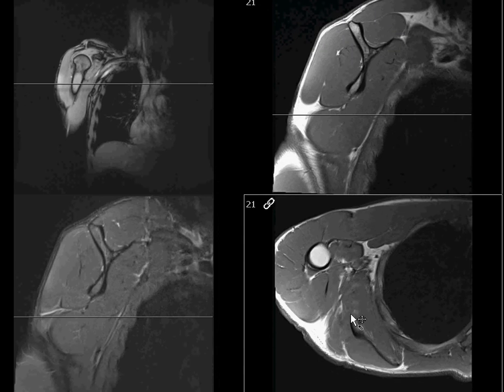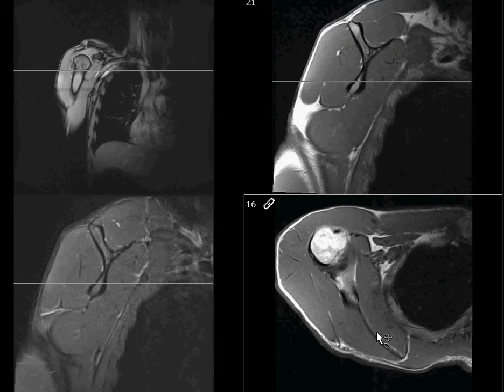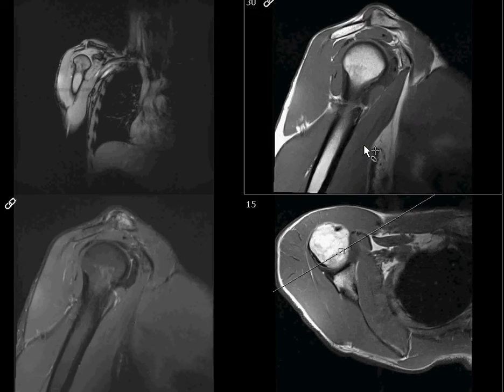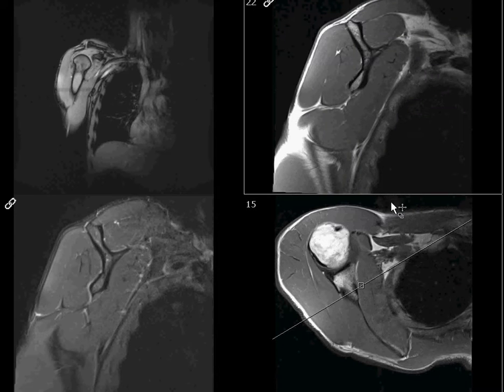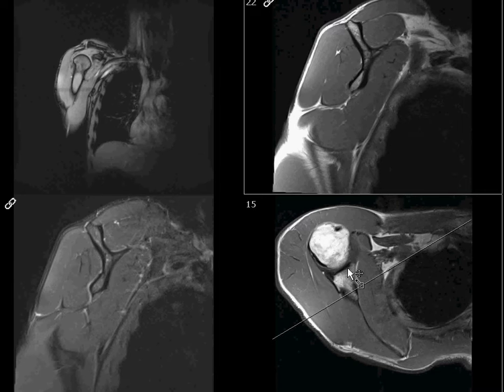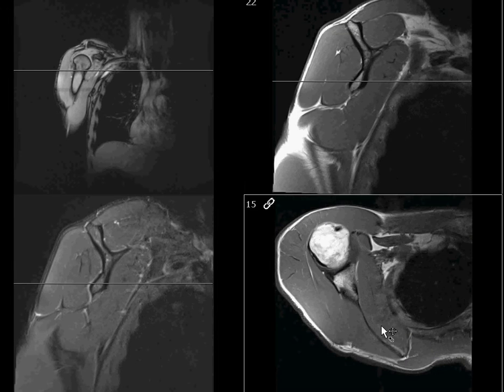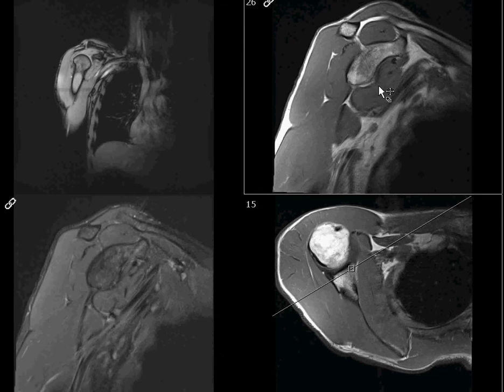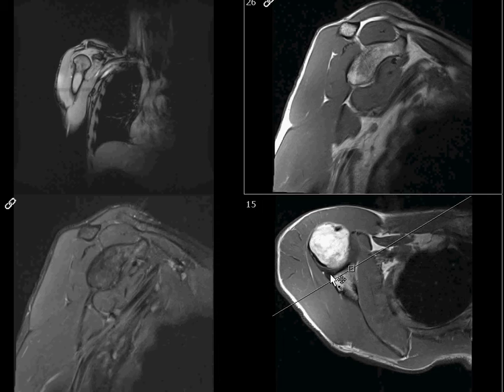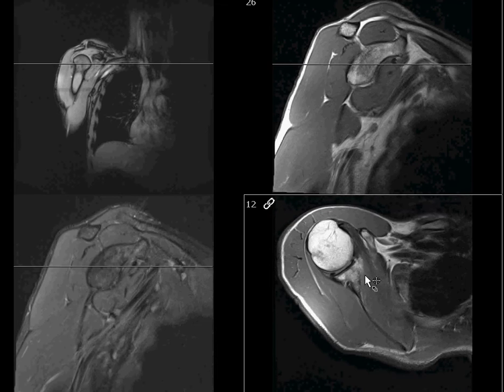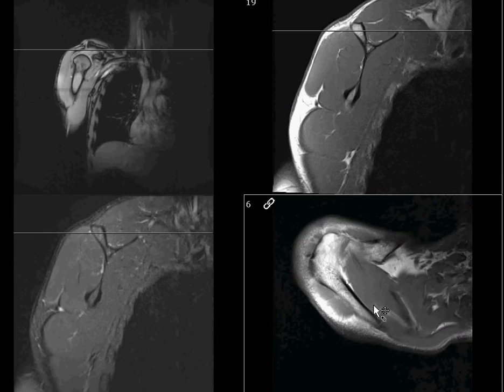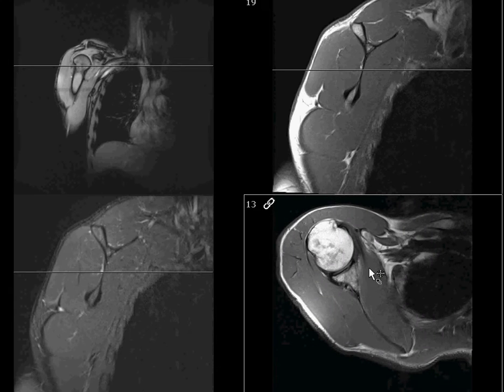The routine thing is we have a T1 here and a T1 sagittal — though note it's an oblique sagittal, oblique relative to the plane of the scapula. Just like almost all musculoskeletal imaging, we want to be orthogonal to the planes of the structure we're imaging. So this sagittal is like a sagittal of a shoulder prescribed on the glenoid surface, and we want to go through the whole scapula, based on the axis of the scapula.